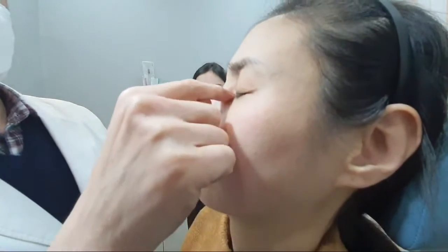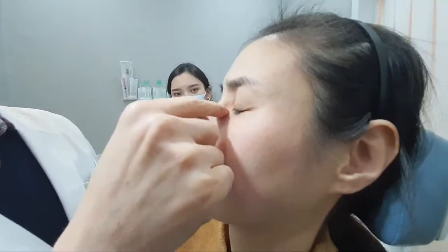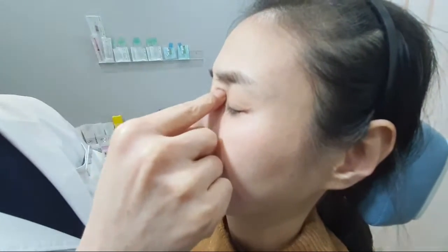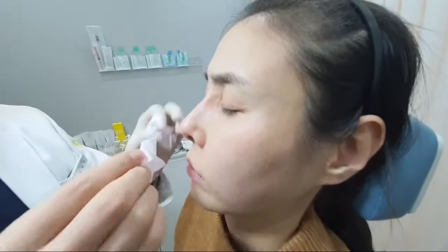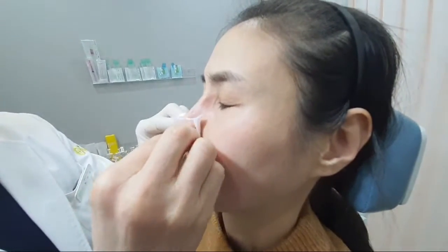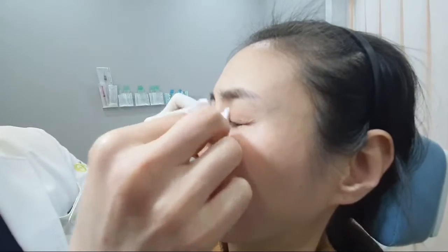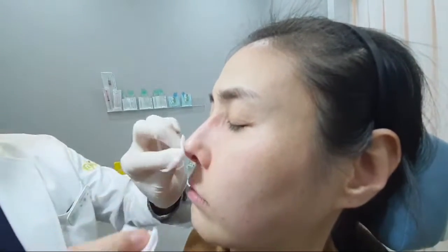동맥은 여기 어치에서 나오죠. The artery is at the point that he's pointing right now. That is where the artery is, and that's where you should be avoiding. That's why when making the injection, he's putting pressure with his left hand on the bridge in order to prevent from hitting the artery.